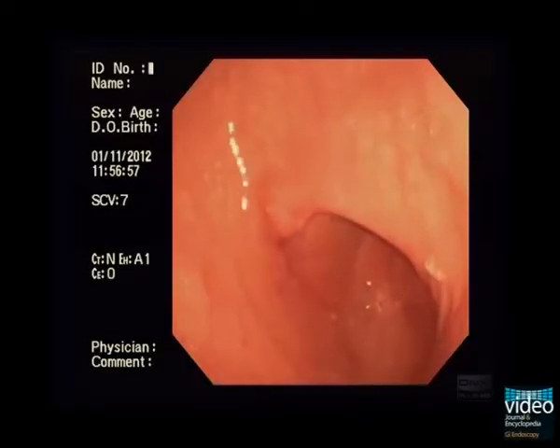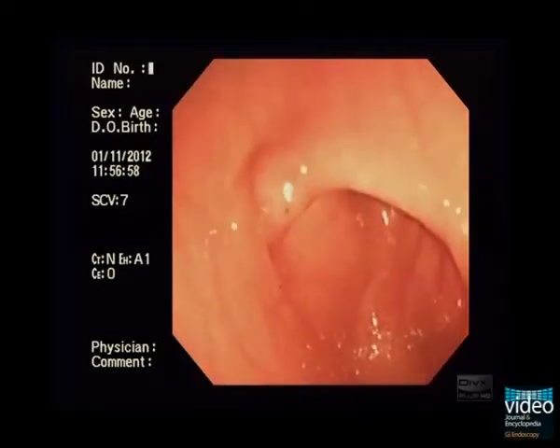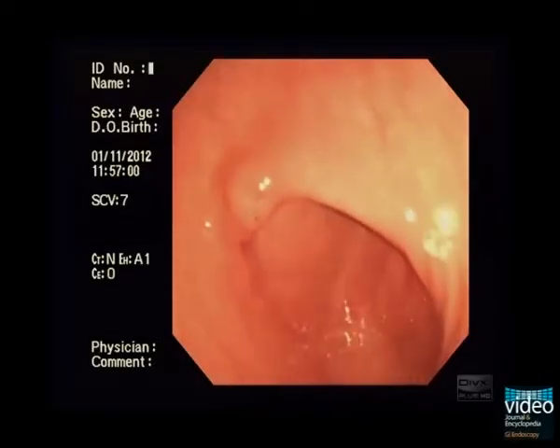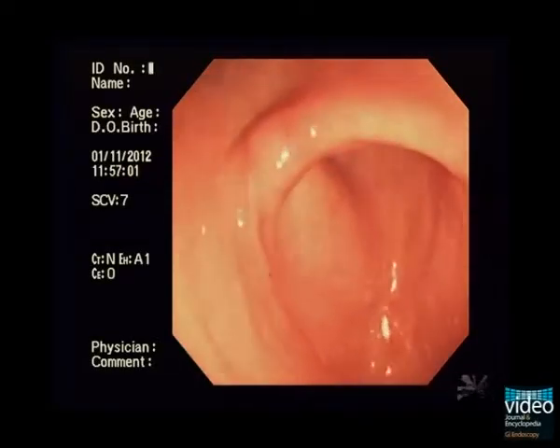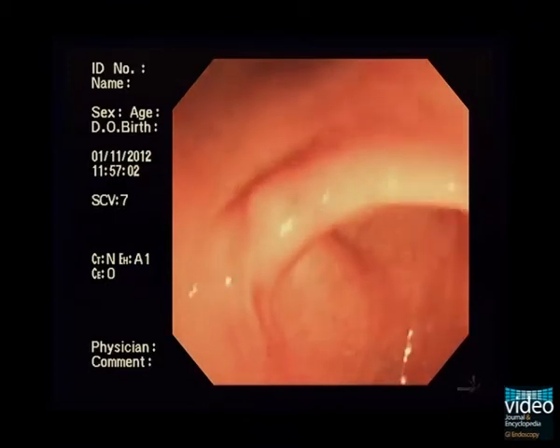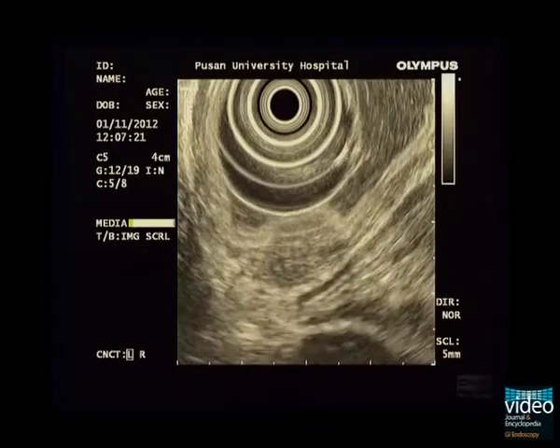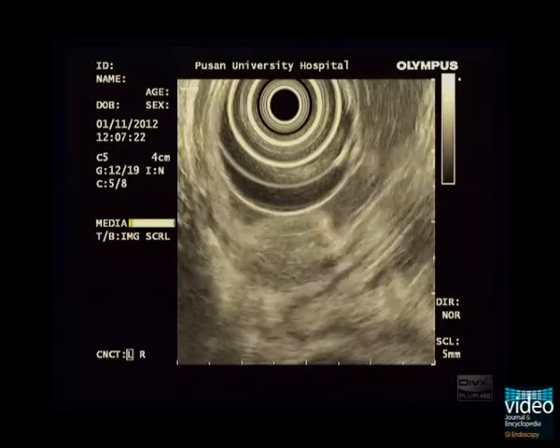An approximately 2.5 cm-sized round submucosal tumour is seen at the angle. At its centre there is some discolouration; however, neither definite umbilication nor opening is observed.